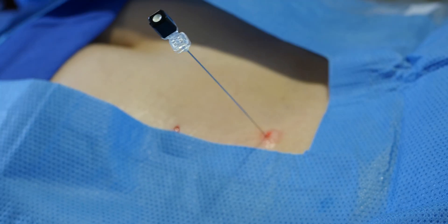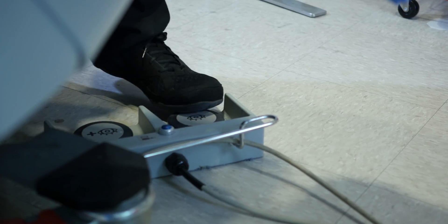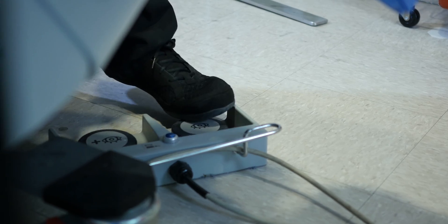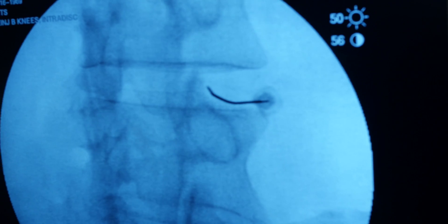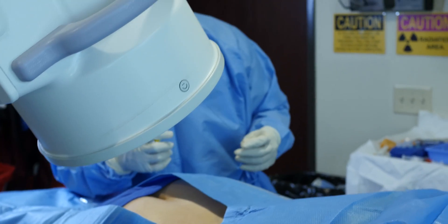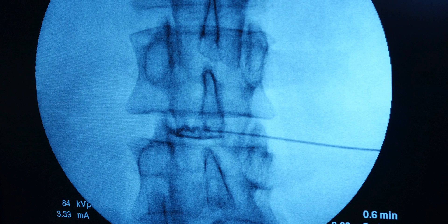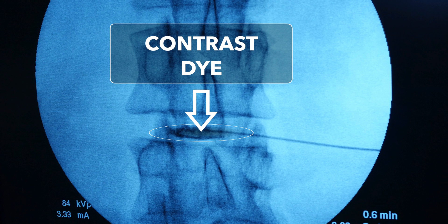We're guiding our needle with fluoroscopy, which is basically live x-ray. I take a picture, advance the needle, take a picture, advance the needle — now we're in the disc. We clearly see our needle. We want to make sure that on the x-ray we can show where our medicine will go. Since medicine is invisible on x-ray, we're going to inject contrast dye that shows up on the x-ray to confirm that we're actually inside the disc.